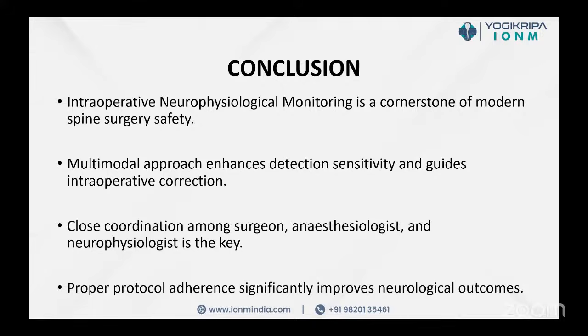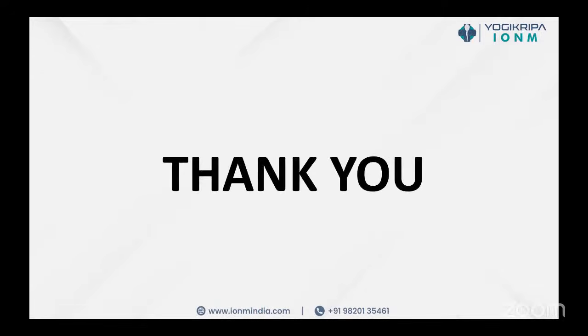The conclusion. Intraoperative neurophysiology monitoring is a cornerstone of modern spine surgery safety. A multimodality approach enhances detection sensitivity and guides intraoperative correction. We cannot depend only on one modality like SSEP or MEP. Try and use multimodalities. Close coordination with the surgeon, anesthetist, and the neurophysiologist is the key to success of IONM. Proper protocol adherence significantly improves the neurological outcomes. Okay, thank you.